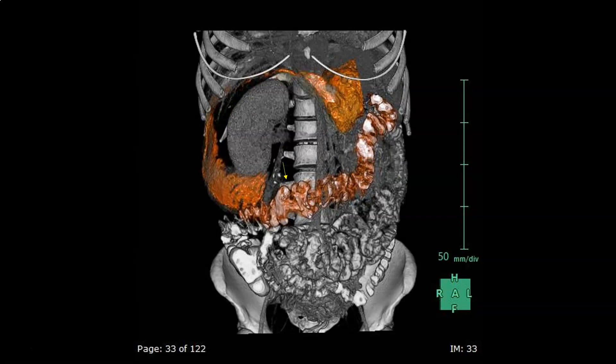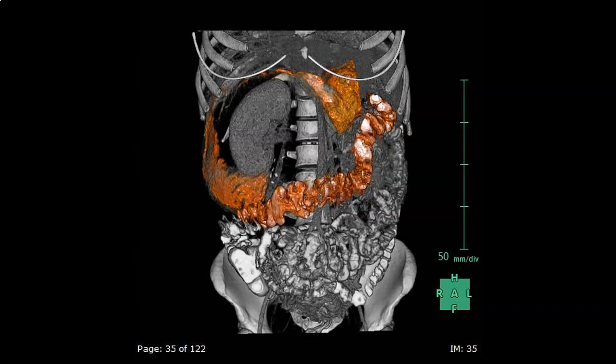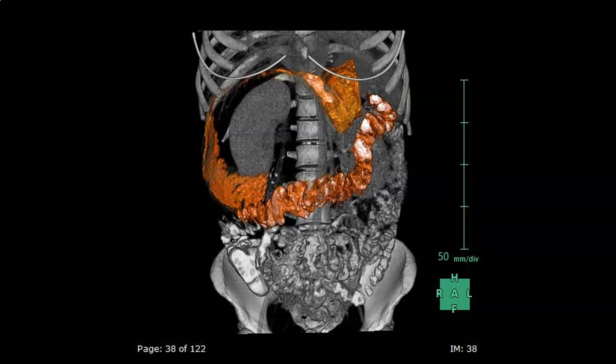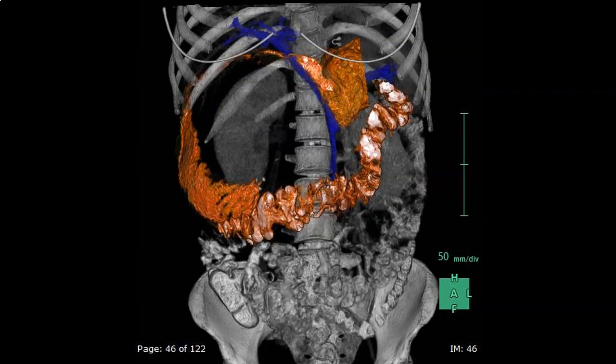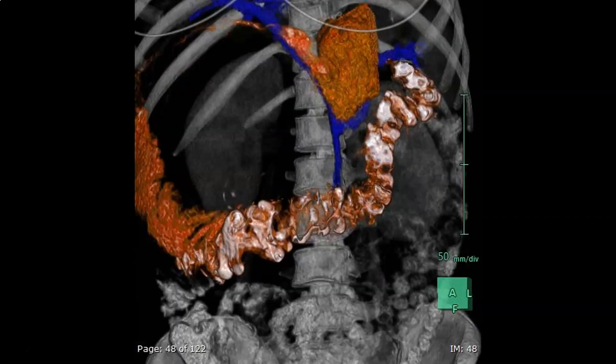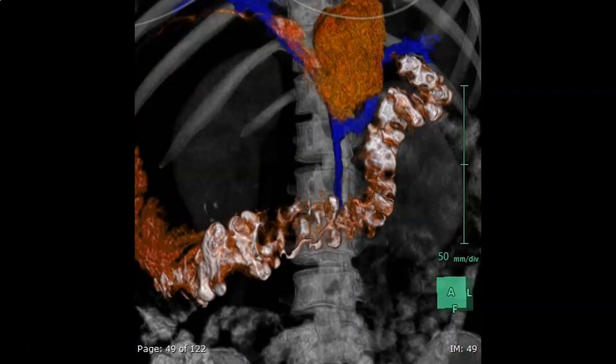We see here the downward displacement of the transverse colon by the lesion. This is the portal vein formed by the confluence of the splenic and superior mesenteric vein, displaced to the left — a typical displacement pattern of pancreatic head lesions.